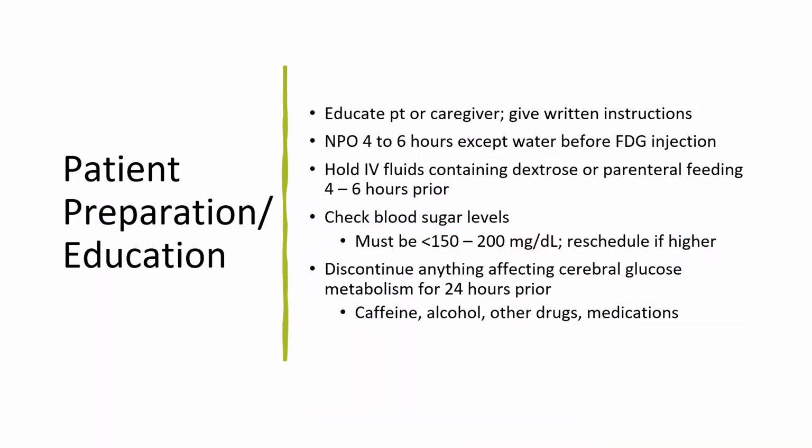So that's really important that the patient or caregiver be educated and given written instructions. There's a diet that needs to be followed, plus the blood sugar, plus the prep of a quiet dim lit room. So there's a lot of moving parts to an FDG study that really have to be followed because if they're not, it will impact the glucose metabolism.